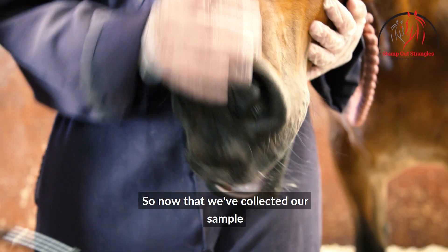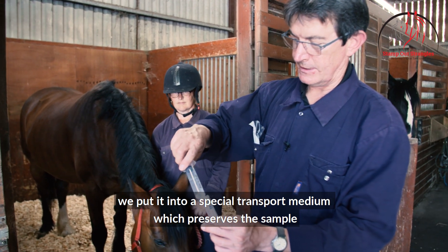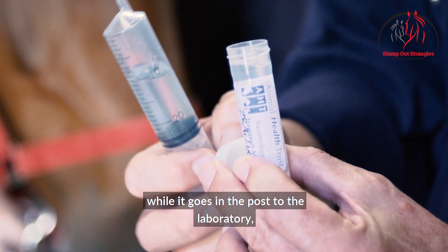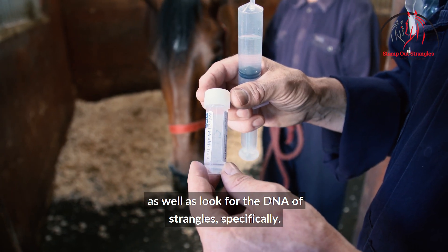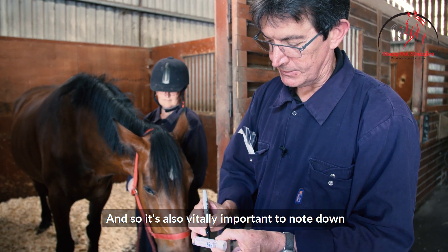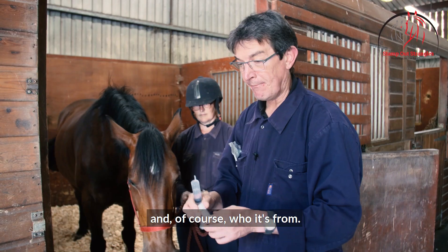Now that we've collected our sample through the endoscope from the guttural pouch, we put it into a special transport medium which preserves the sample while it goes in the post to the laboratory. There they can culture for live bacteria as well as look for the DNA of strangles specifically. It's also vitally important to note down when you collected the sample and of course who it's from.